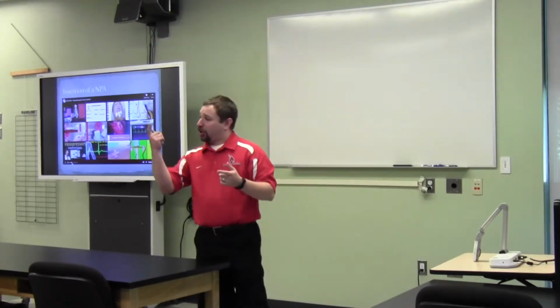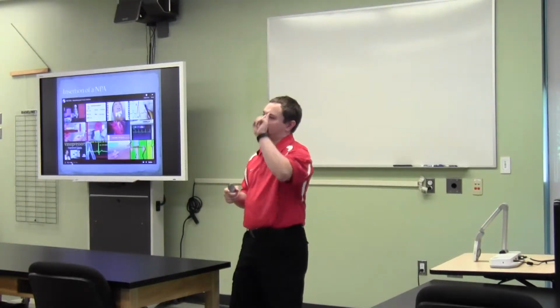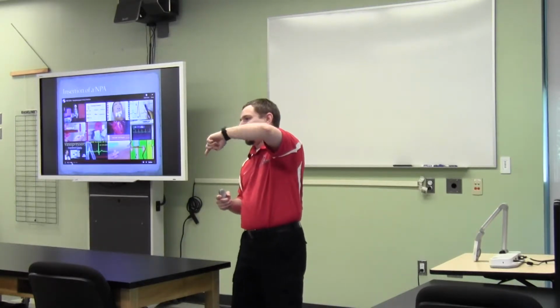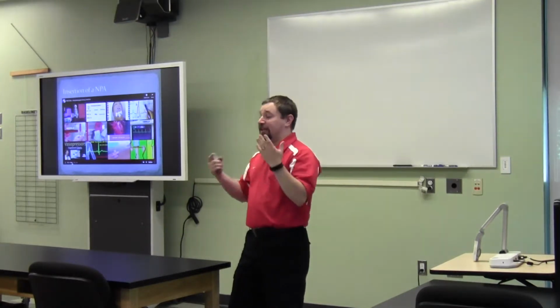Yes and no. You saw that it's got a curve. Okay, if I don't turn it at the right point, I can actually end up feeding that into a sinus. Or it gets stuck up in the upper nasopharynx, and it doesn't ever pivot down. And at that point, I'm creating a lot of ventilation up into the sinus, but I'm not getting that control deeper. So it's one of those things that it's theoretically possible.